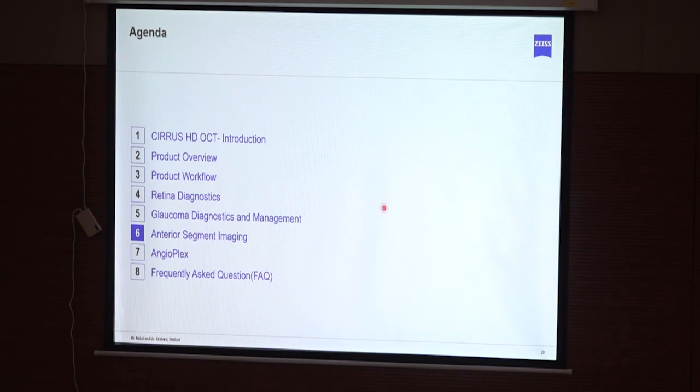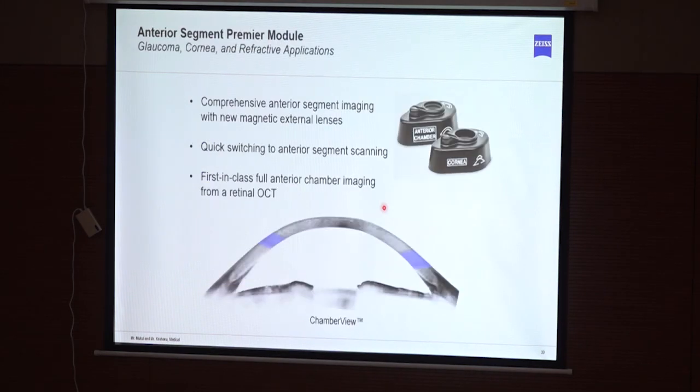And the third part of OCT is the anterior segment. So in the anterior segment, we have two attachments.